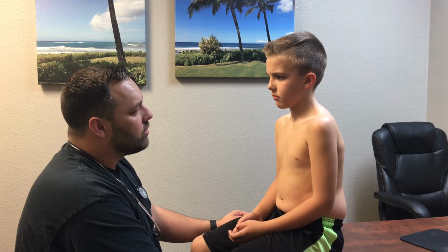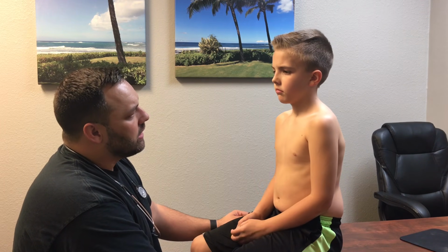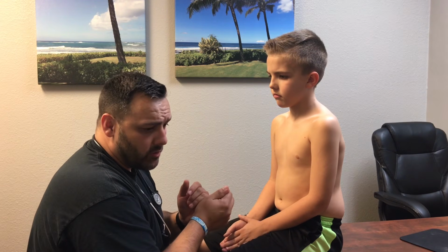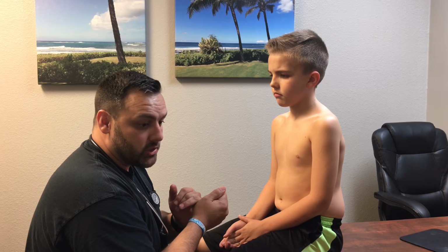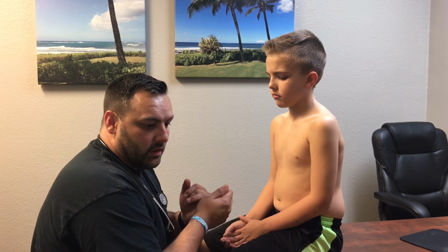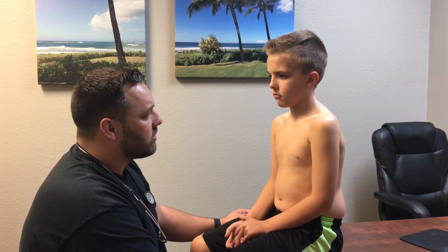Then the next thing we're going to do sitting up here is that we're actually going to listen to the carotid artery. And it's always look, listen, feel. And that's how I remember it. And then in medical terms, we're talking about inspection, auscultation, and then palpation. Okay, so we're going to auscultate first his carotid artery.